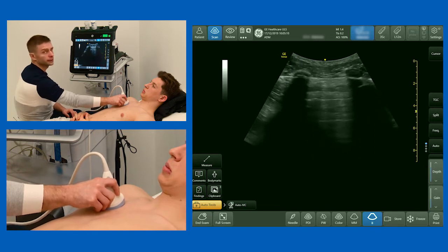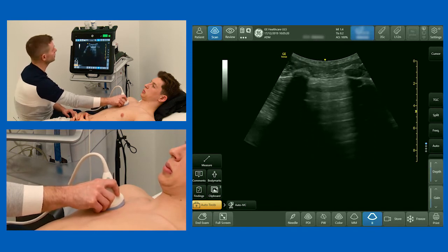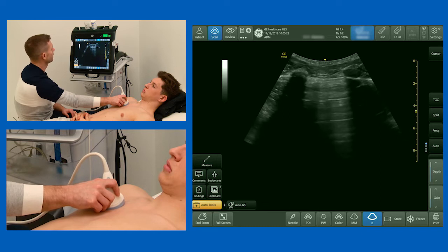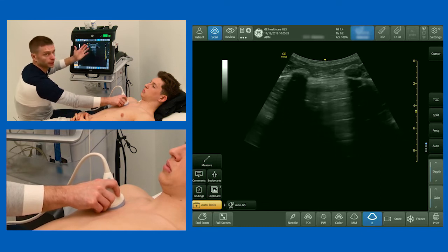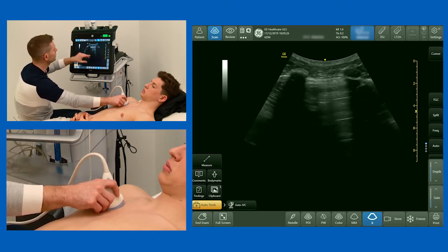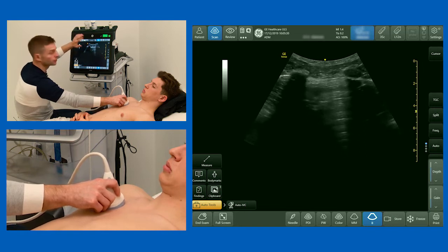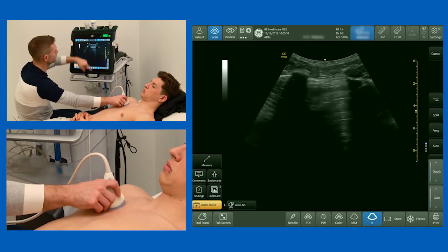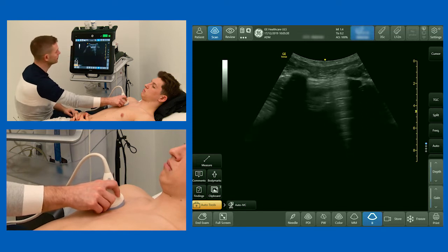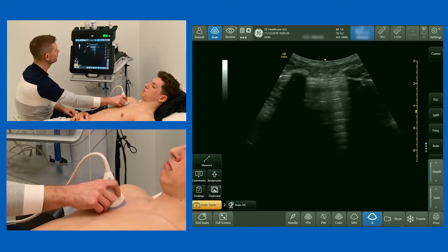Other pathology we might see, other than absent lung sliding, would be things like consolidation — which will be below the pleural line as echo-poor areas — or things called B-lines, which look like comet tails coming down from the pleural line, extending from the pleura to the depth of the image and moving backwards and forwards with respiration.